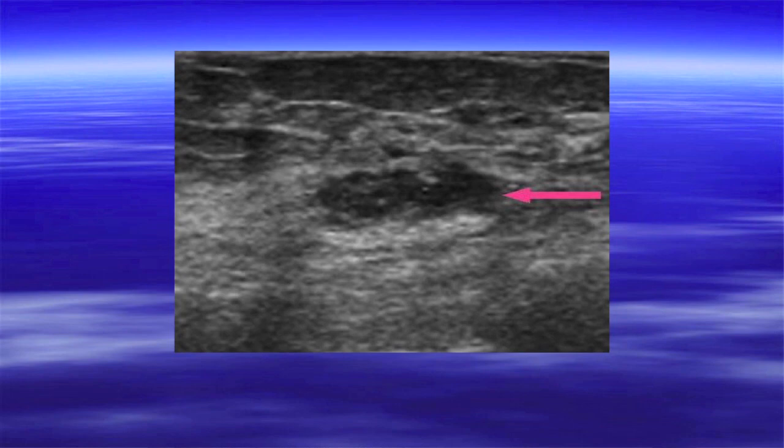Another little bitty one. Nonetheless, it's abnormal. I'd biopsy that because it's irregular. That still might turn out to be something benign. But I'm not going to let that grow because it does not have all those nice features of the other one. Rounded, smooth, pushing, homogeneous internally.